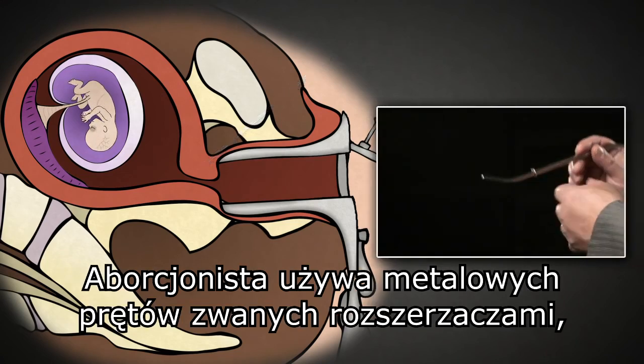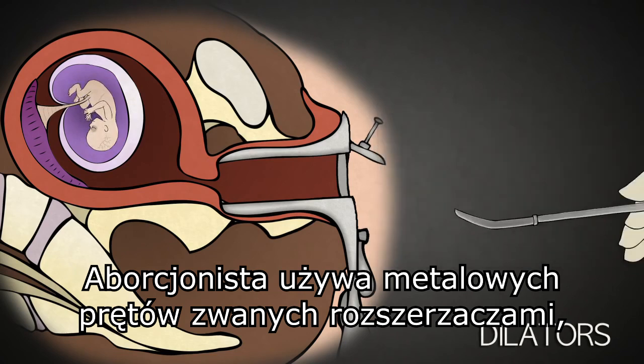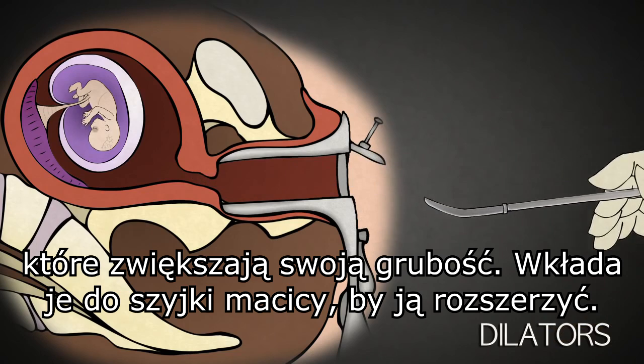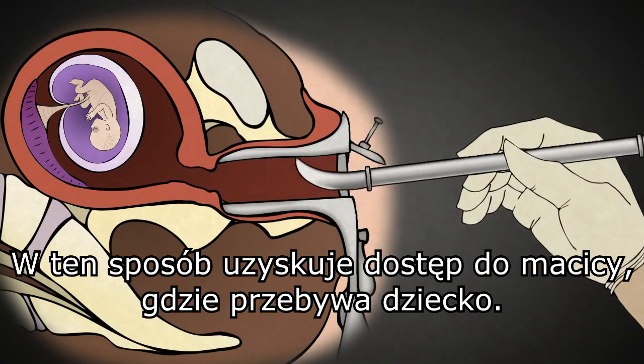The abortionist uses a series of metal rods called dilators, like these, which increase in thickness and inserts them into the cervix to dilate it, gaining access to the inside of the uterus where the baby resides.